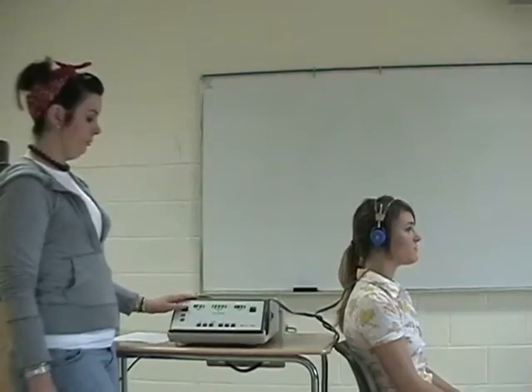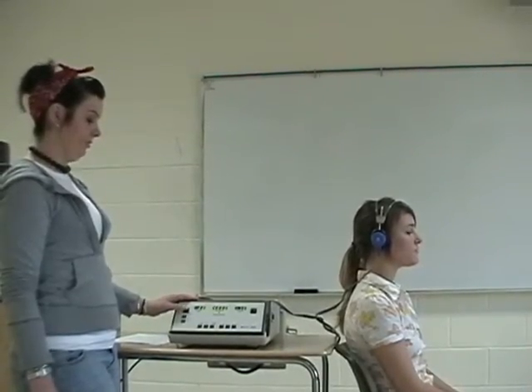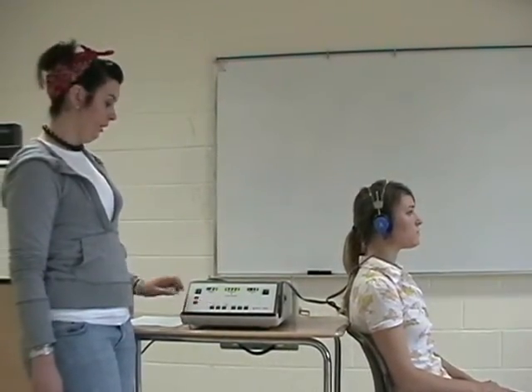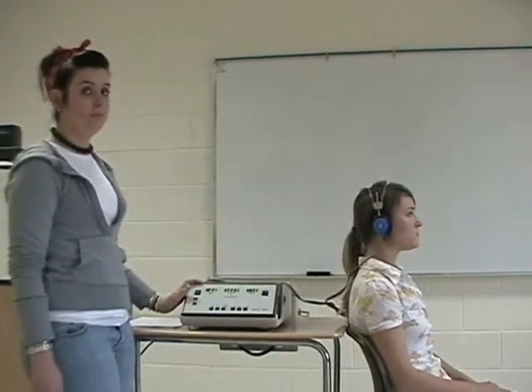2,000 hertz frequency, and 4,000 hertz frequency. These frequencies are suggested by ASHA. After you screen that ear, you're going to press the button to switch it to the other ear, and then you're going to return the frequency to 1,000 Hz and repeat the screening.